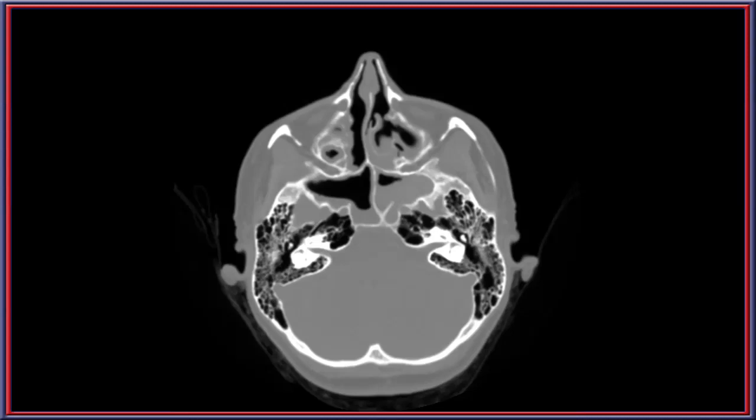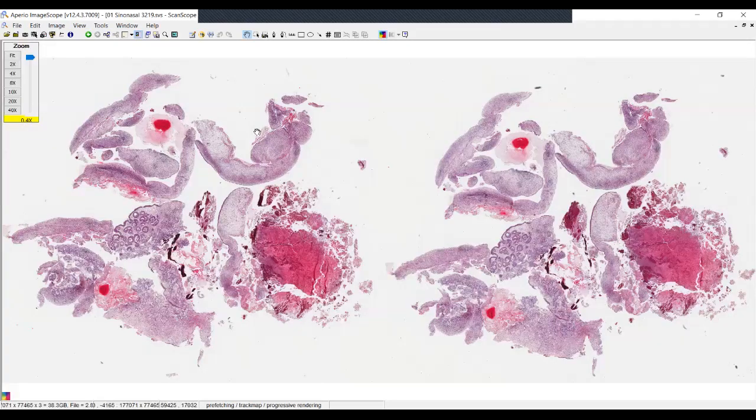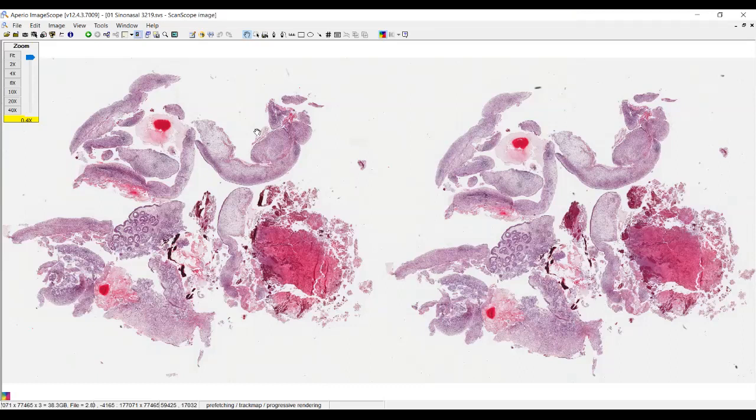I think that you can tell there is a very large space over here that has been destroyed. And in fact, the entire medial wall has been lost in this particular region. I'm going to try and have this work fairly easily, going back and forth between the images to drive as well as the virtual slides. So hopefully this will be what you're able to see each time.